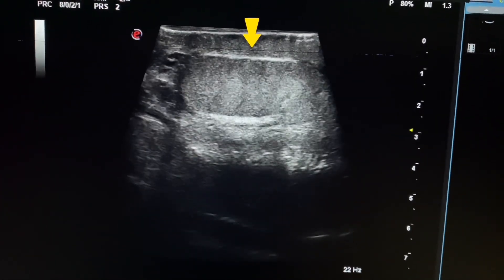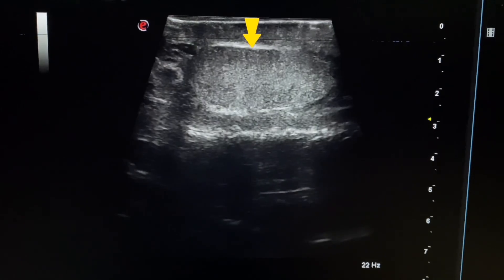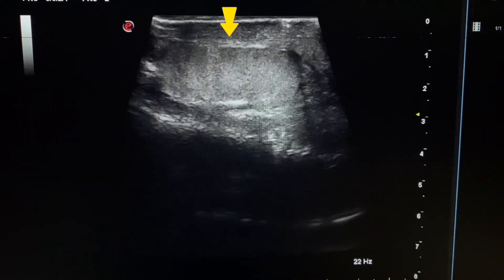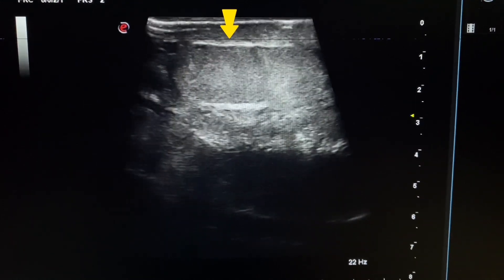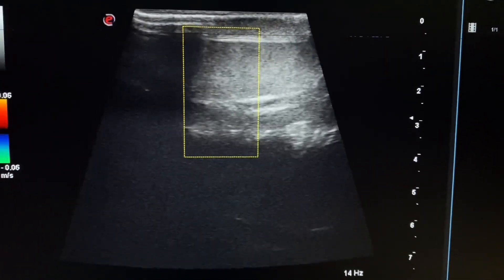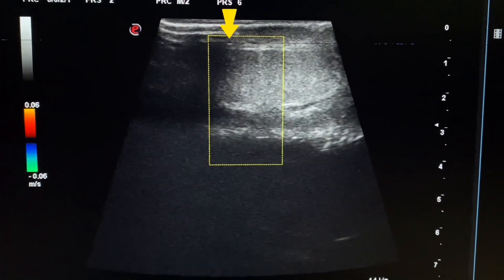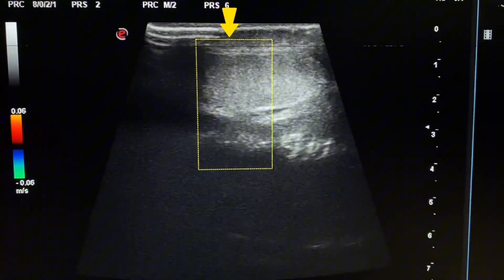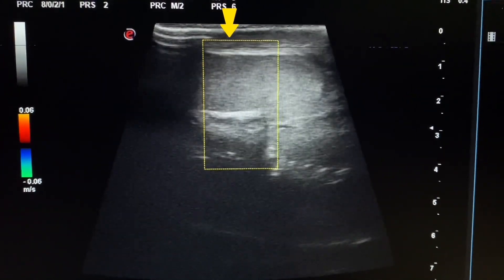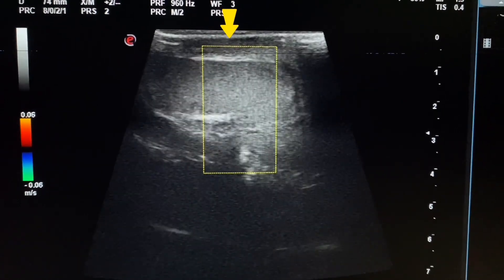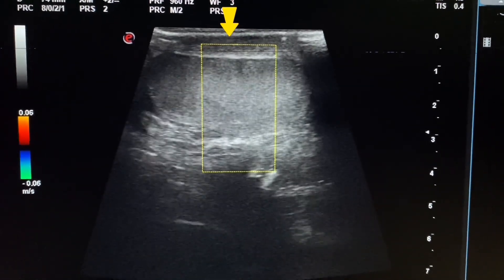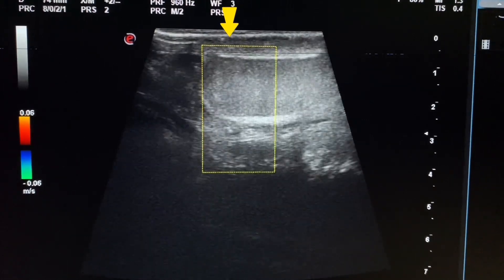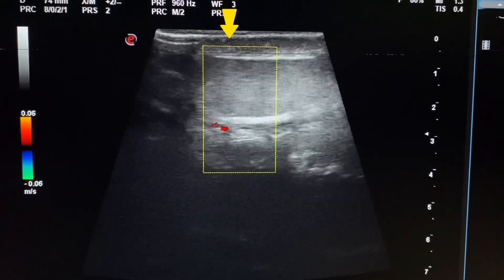This is the left testis. It also shows mildly heterogeneous texture. On color Doppler, it shows mildly increased blood flow.